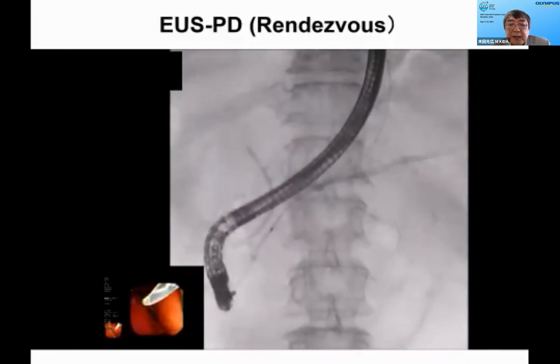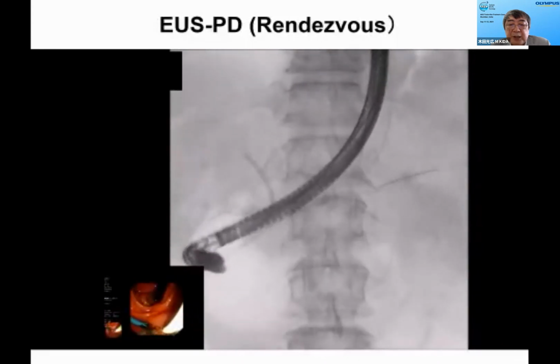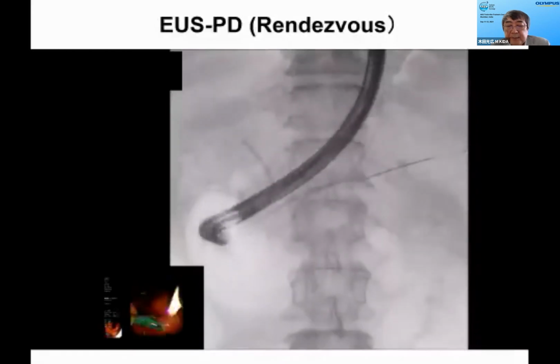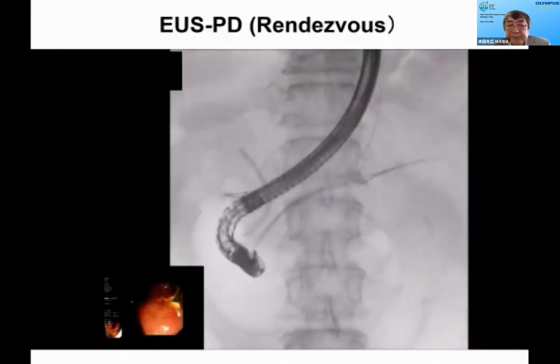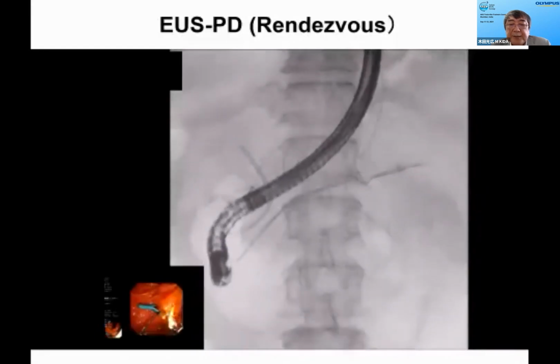And finally, we insert the plastic stent into the MPD. Like this.